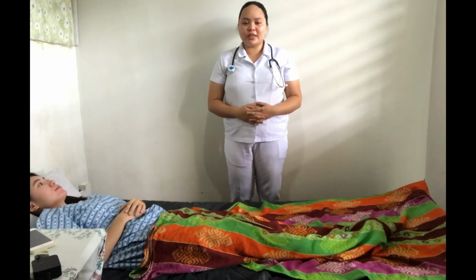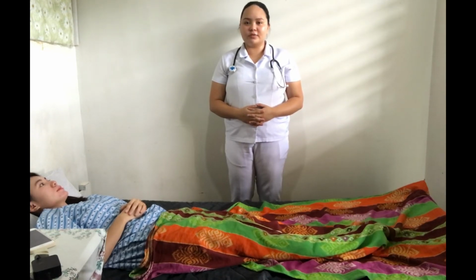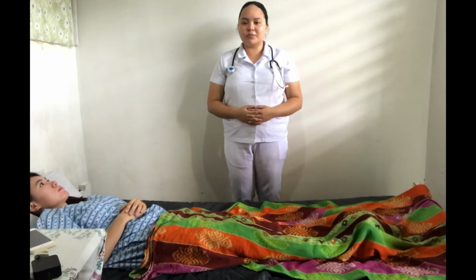So now auscultate for anterior breath sounds, adventitious breath sounds, and voice sounds. Auscultate the trachea, then auscultate the anterior thorax. Place the diaphragm of the stethoscope firmly and directly on the anterior chest wall. Auscultate from the apices of the lungs, slightly above the clavicle, to the base of the lungs at the 8th to 9th rib.